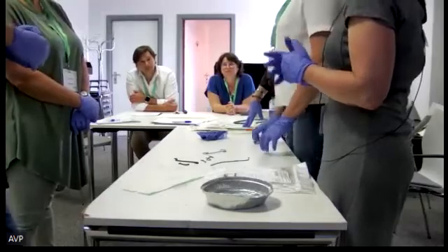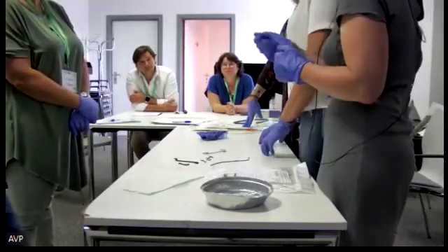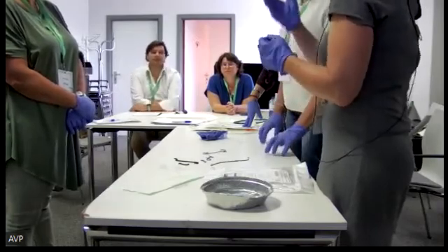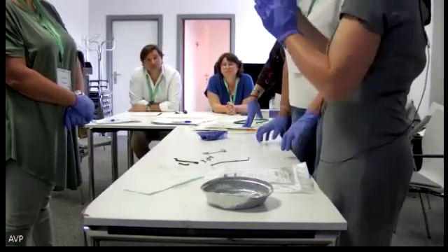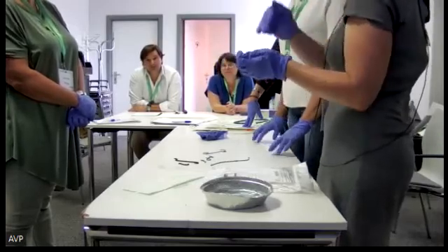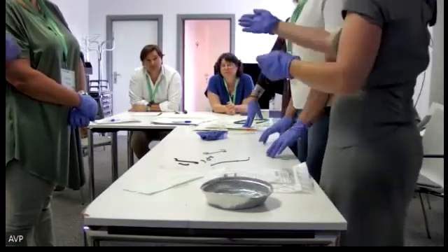Yes, but it's mostly for navigating inside the stricture in the distal anatomy of the bile duct, and very good to choose the intrahepatic bile duct, and also to avoid the cystic duct. If you're always going to the cystic duct, maybe the torque can help you go in the good direction.